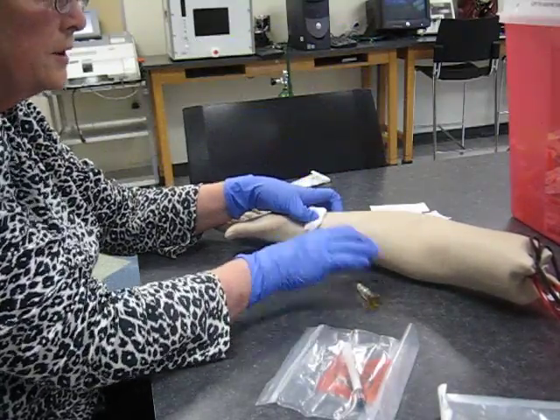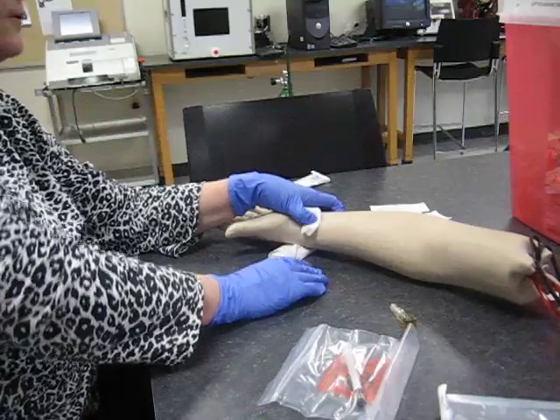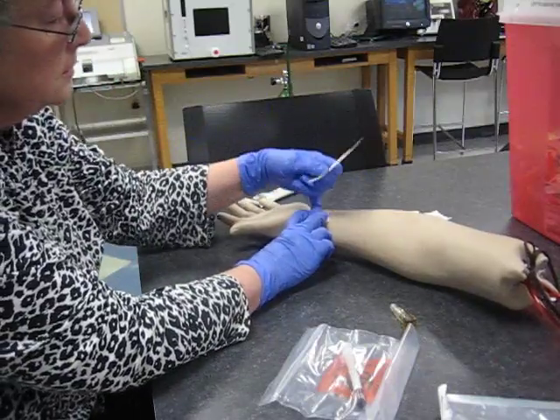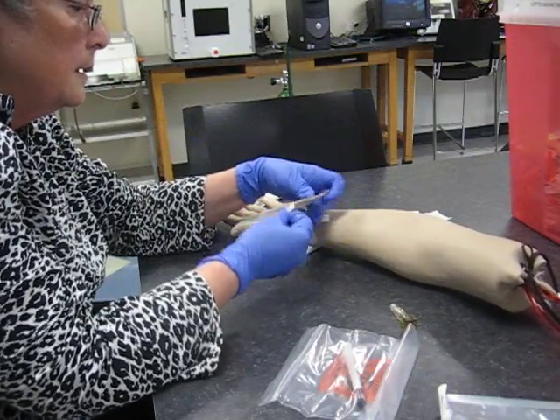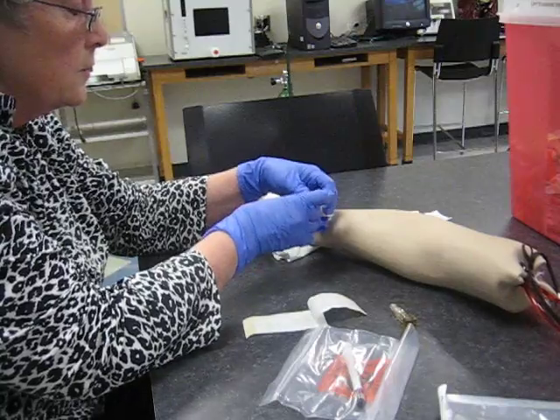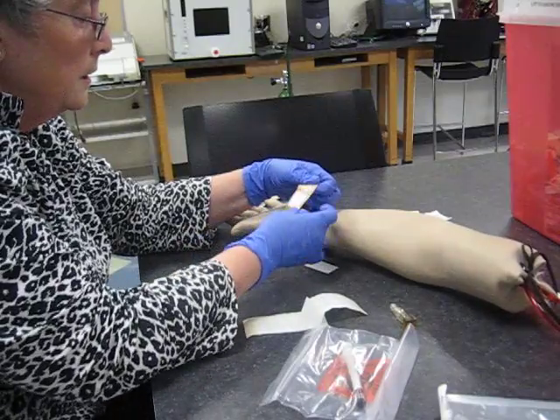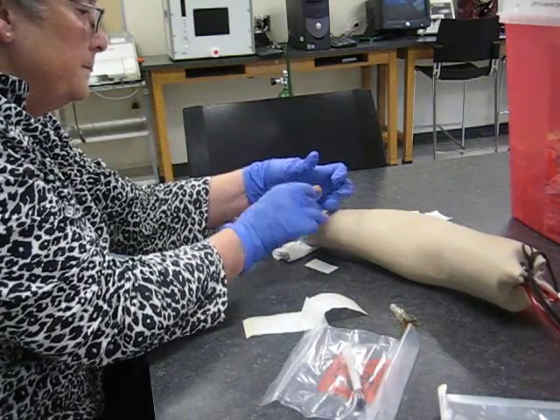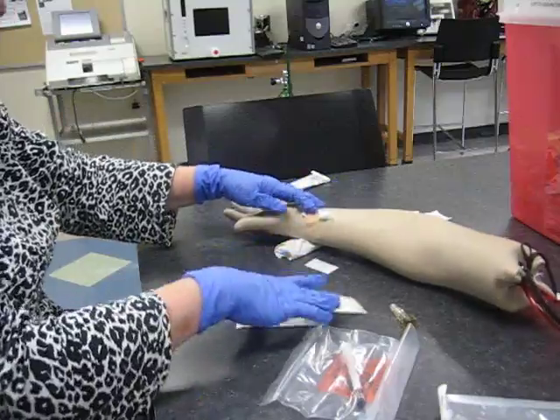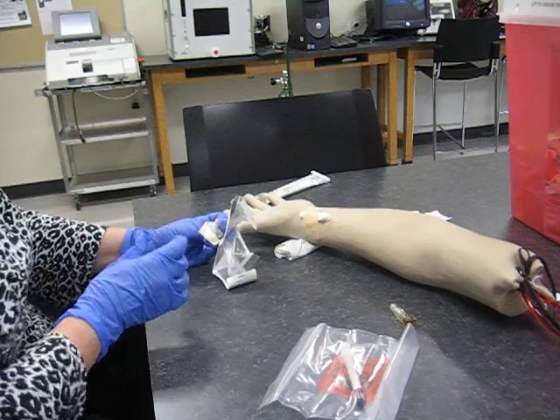Mr. Hand, I'm going to hold this for about five minutes, then I'm going to check it. You're still bleeding — I hold it for another ten minutes and check it again. Whether I put a Band-Aid on or not depends on the hospital. If I put a Band-Aid on, it's a pressure Band-Aid. Go ahead and open up your Band-Aid ahead of time so you can do it one-handed. The pressure Band-Aid goes on. It's going to be a little sore — might be a little bruising, but I held pressure so hopefully it won't be much.